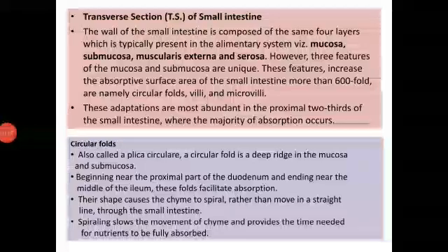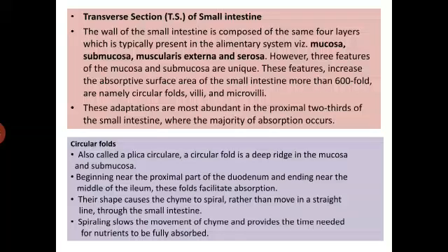Good morning, students. Today is our next lecture, and that is about the transverse section of small intestine. We have learned until now about the transverse section of stomach, and we have seen that stomach has a very important role in digestion. But small intestine has a very important role in absorption. Okay, so we are going to see the transverse section of small intestine.